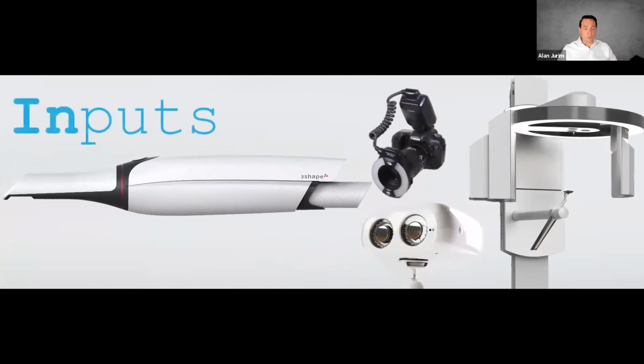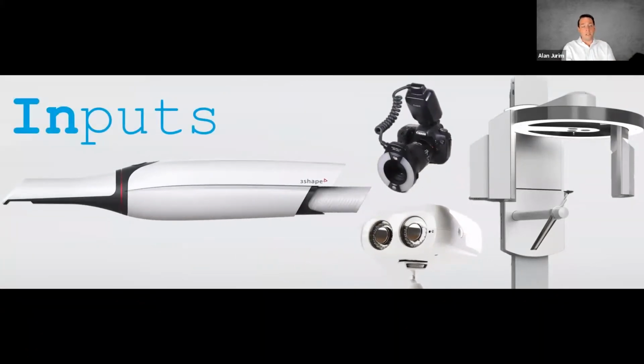And out of all the different tools, the inputs are the ones that are going to allow us to digitize our patients. So we have an intraoral scanner. We use a 3Shape Trios. We have intraoral photography. We have 3D X-rays. We have 2D X-rays. We have other types of scanners like a PIC scanner, a photogrammetry scanner. And all of these tools allow us to get the digital information into the computer, the data. They allow us to record the data.